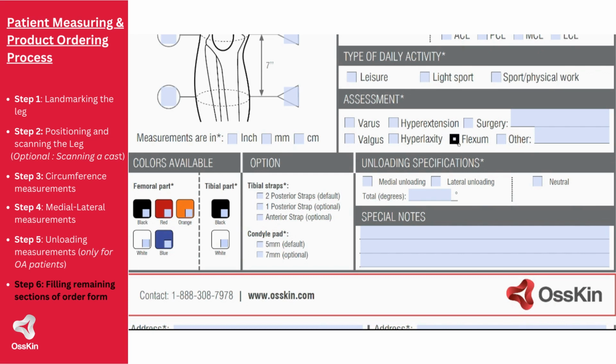If the patient has a flexum, so a knee contracture at the knee, please identify that the patient has a flexum and quantify it here in the other portion to identify how many degrees of flexion. That way the modelizers will respect that angle of flexum. We then go into the unloading specifications that you have measured.